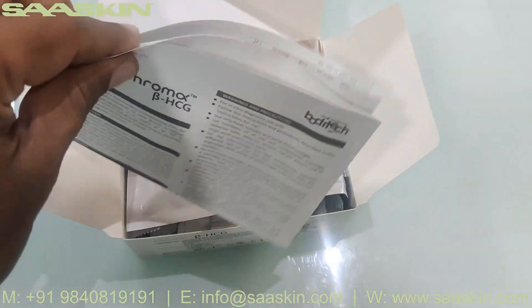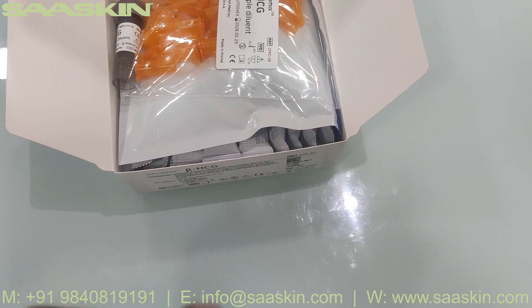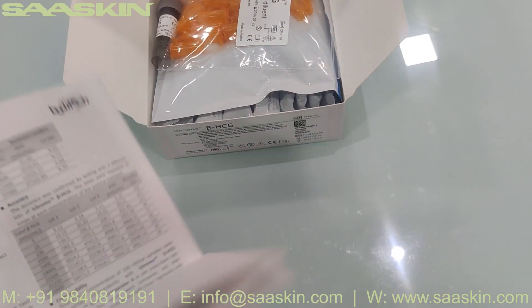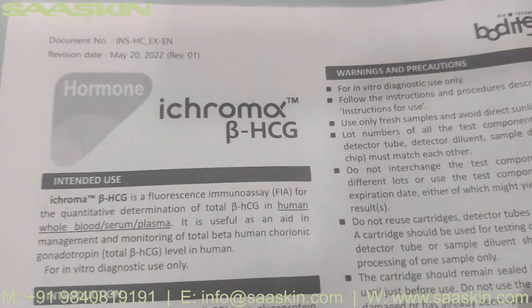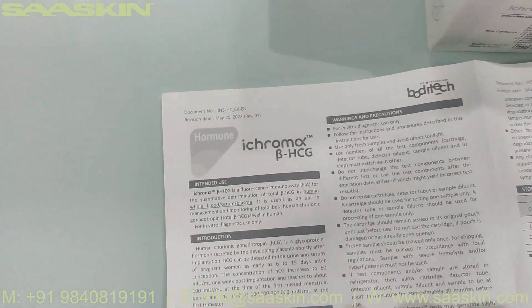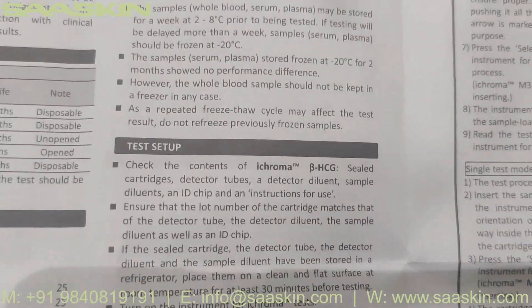Inside the box you can see one IFU brochure here. It says iChroma Beta HCG. In this IFU brochure you have all the information like intended use, principles, components, warnings and precautions to be taken on this test, the stability conditions, and the materials provided. You also have the sample procedure, test setup, test procedure, and interpretation of test results — so you have the complete information to conduct the test.